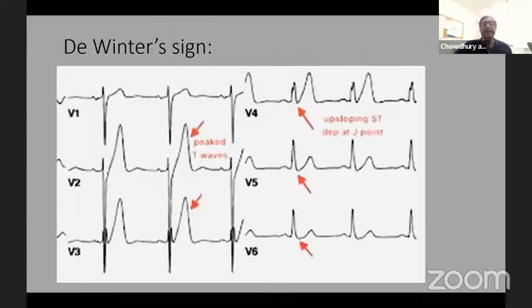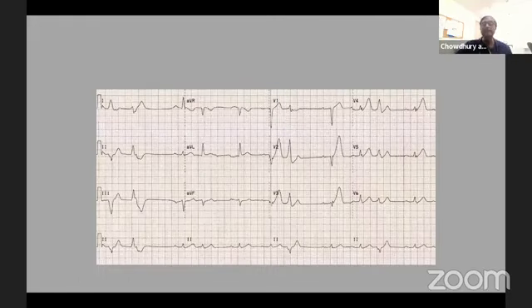And De Winter sign, which is the very acute angle ST changes. If the clinical context is right, this is LAD. It is very important to recognize that and see how this ST changes. If the presentation is right, I would not say that you give lytics, because I'll talk about that later. Many of them may have some TIMI 3 flow, but with high-grade stenosis presenting like this, it is better to think about revascularization than give lytics.